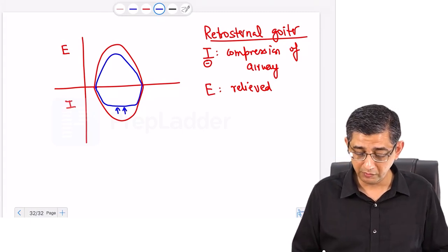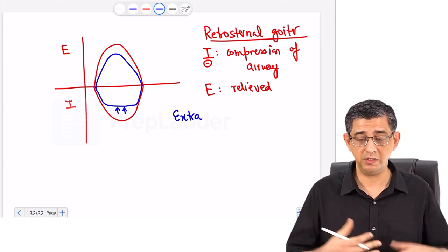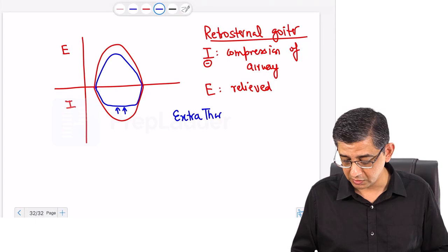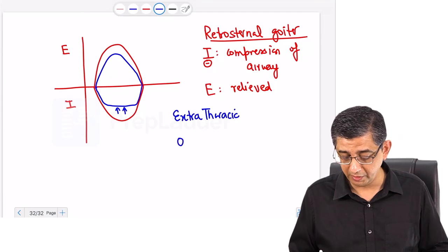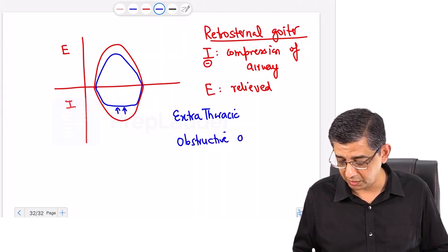So the technical word I want you to remember is that this is, once again, an example of an obstructive airway disorder. But where is the obstruction present? Is it in the lungs? It's not in the lungs, no, it is coming from the chest. So the first word I'm going to squeeze in here is that this flow volume curve is representing an extrathoracic. Leave a line in between. If you're noting it down while I'm saying it before you, this is an extrathoracic obstructive airway disease.